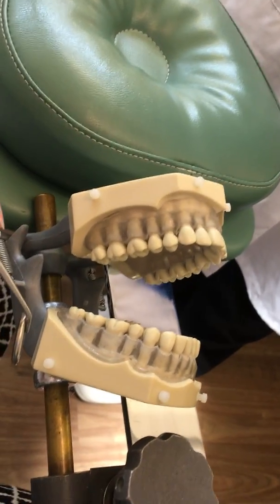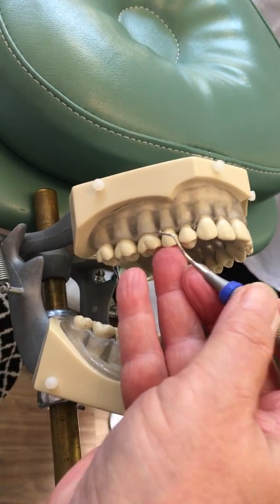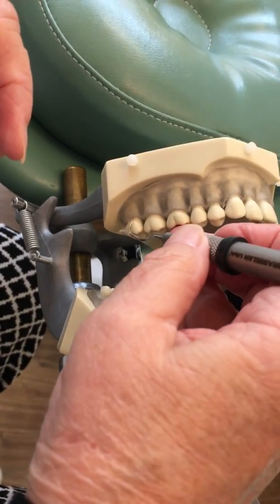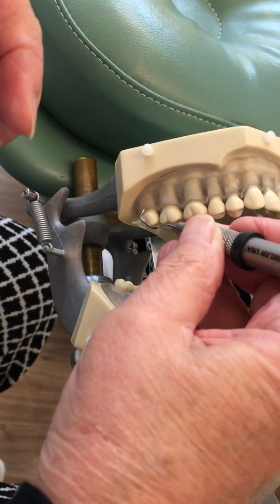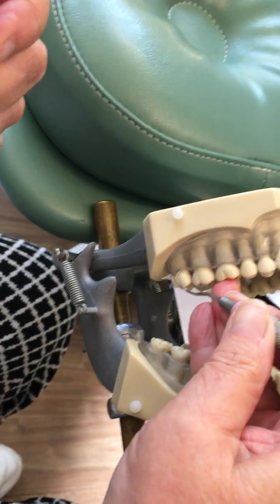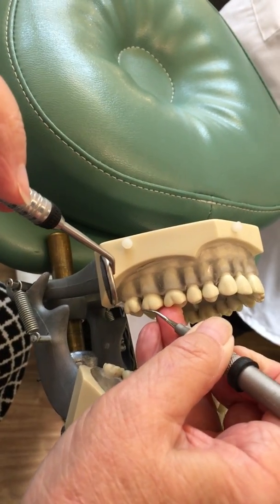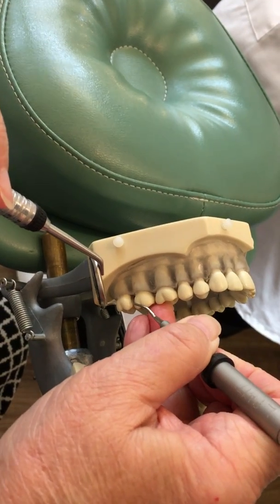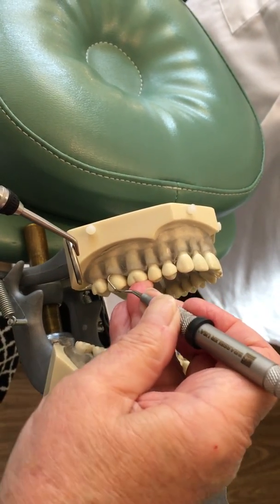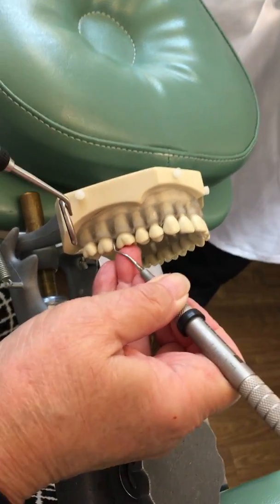We're going to move to the mesial and use the 15-16. Palm up, stretch your fulcrum up, and we'll check it on the mesial. We're going to roll over our fulcrum, place our toe at the distal line angle going apical, insert closed, and then open with oblique strokes across the buccal. I'm using my mirror to retract the cheek. As I come around the corner, I've turned my hand back up — I'm rolled over, close, open. As I get to that mesial line angle, I've twisted my hand back up, and that gets my shank parallel.